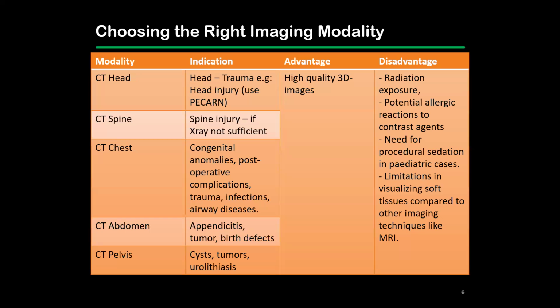Again, you may have an abdominal CT ordered depending on the scenario of your child, coming in maybe with symptoms related to appendicitis, or you're thinking of certain birth defects. And then you can also order a pelvis CT, for instance, if you're thinking again of urolithiasis.